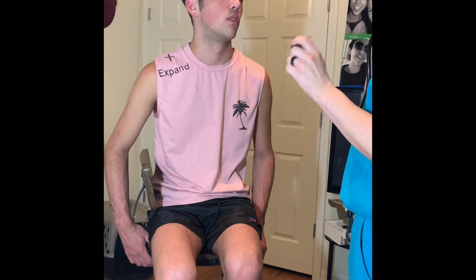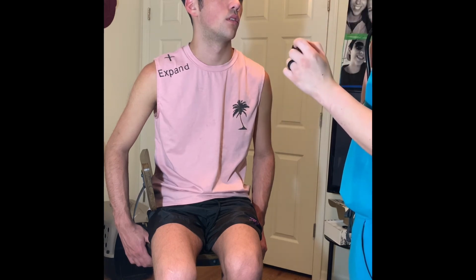Perfect. Okay. Now, the last thing I have to do is listen to all the lobes of your lung from the front side, okay? And just like before, every time you feel my stethoscope, deep breath in and out. And we'll move on to the next one and repeat, okay?